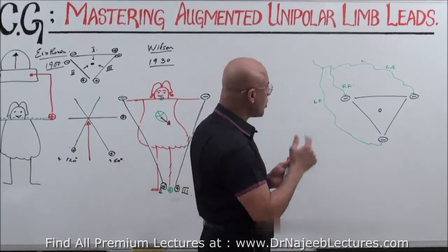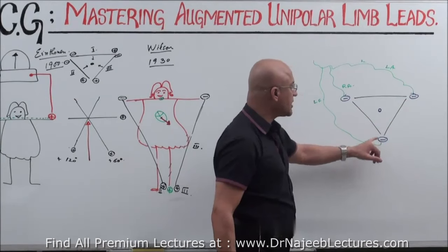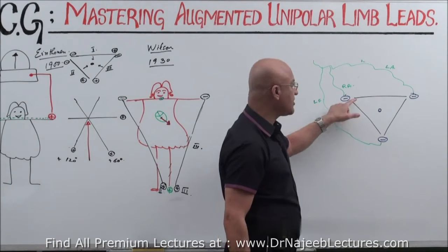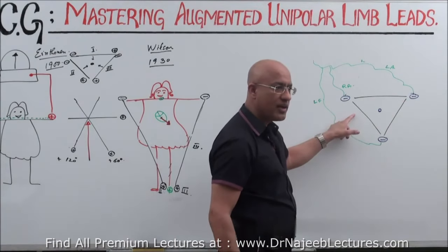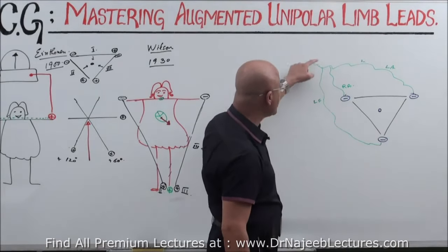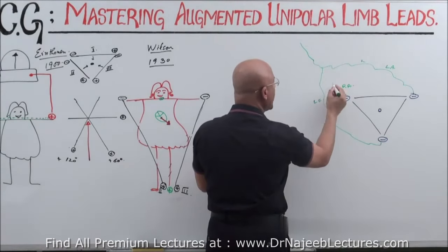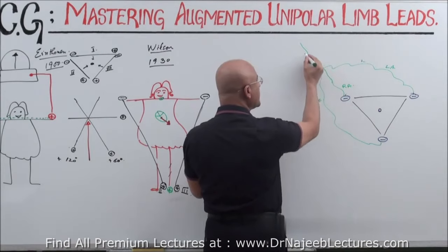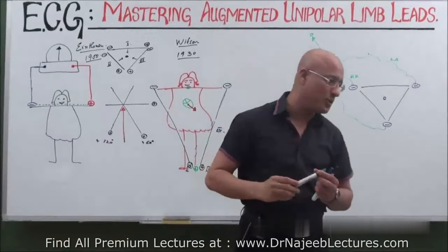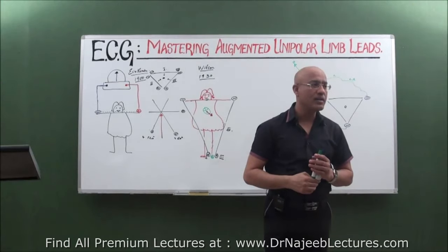Wilson and his team concluded that if we measure the potential at the three corners of an equilateral triangle, and we sum them together, what do we get? We added them here. These three wires are added to each other. Then this point will detect how much potential? Almost zero. So this is how he decided to make an indifferent electrode.